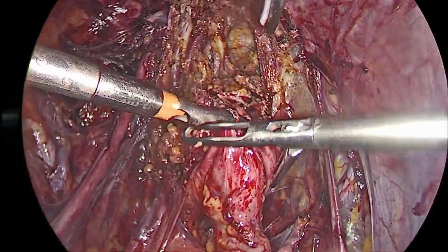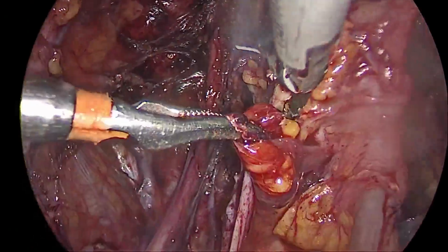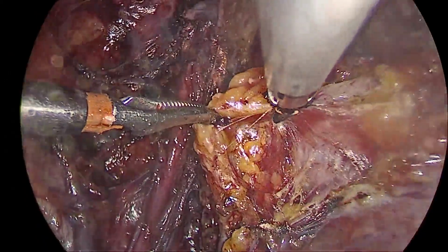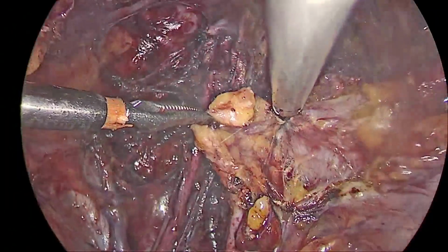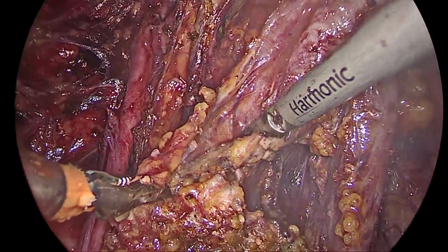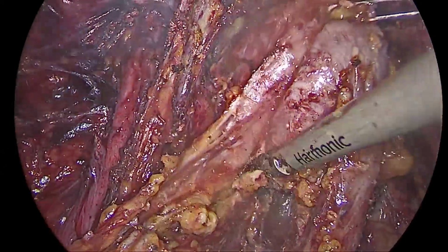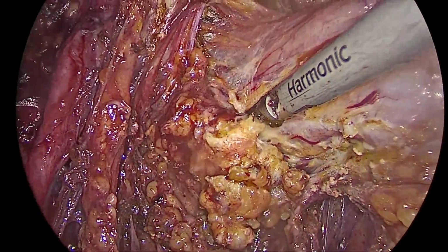The segmental resection can now be performed. Here, we use a mesentery-sparing technique to avoid the unnecessary disruption of vascular and lymphatic supply to the rectosigmoid colon. The bowel mesentery is dissected off of the bowel wall, starting at the proximal edge of the lesion, and moving circumferentially until a fenestration is achieved posteriorly. The dissection is pursued caudally and ends when the distal edge of the lesion is reached. If needed, the sigmoid colon can be mobilized to avoid tension on the anastomosis.